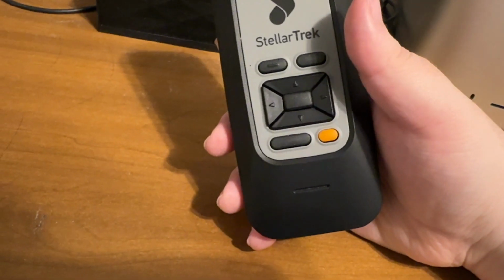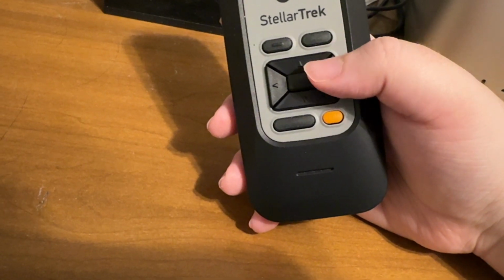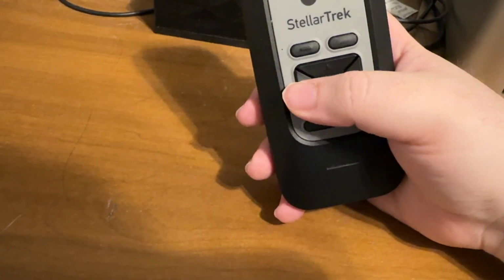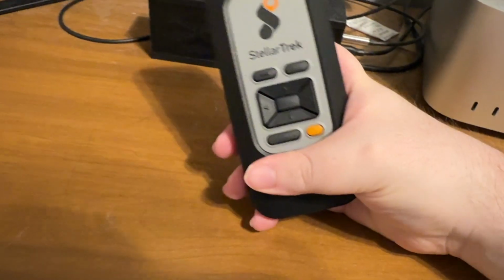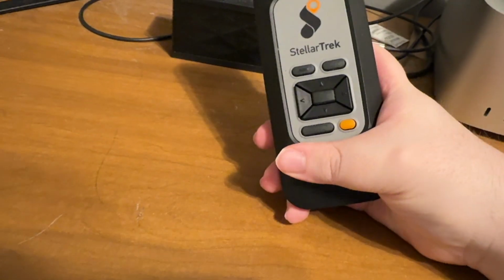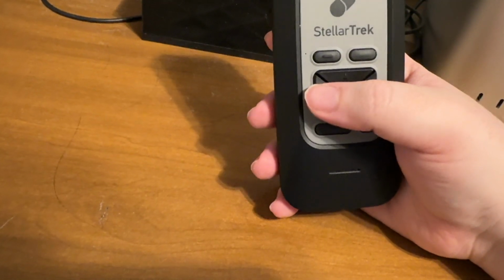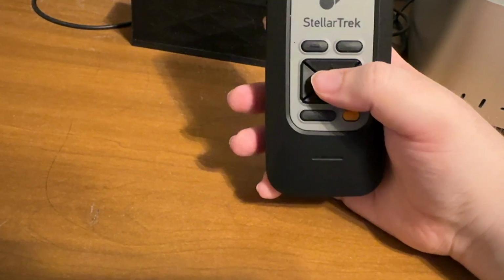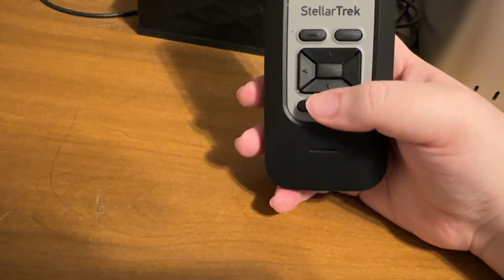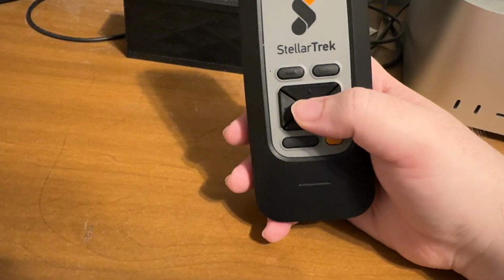And now it is being spoken by the text-to-speech. We're currently in our landmark selection. And what I want to demonstrate is another way that we can enter an address. And that is via voice. So let's give this a try. Sort. Enter an address. So if I say enter an address, Select a country. 1 country. United States. We do have select country, United States.